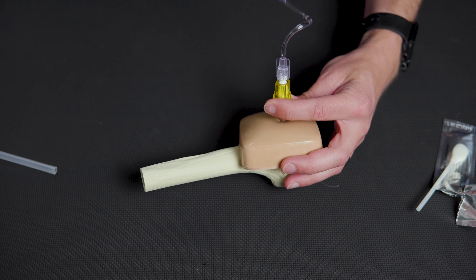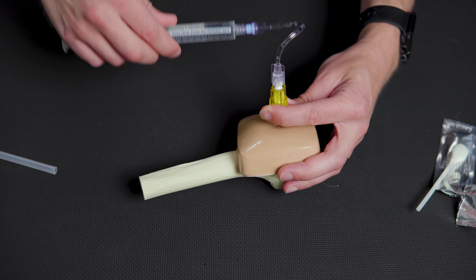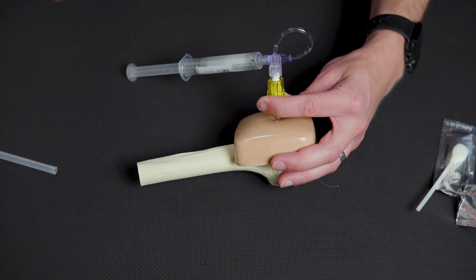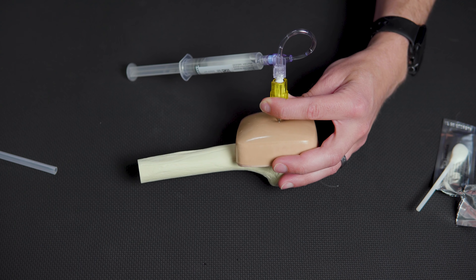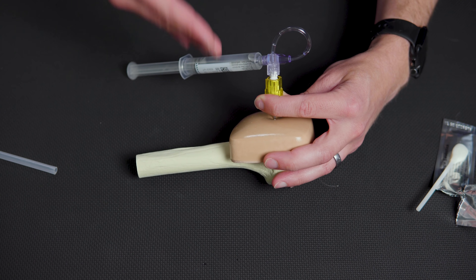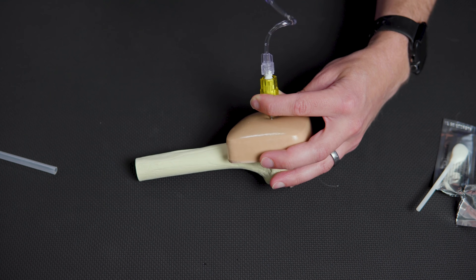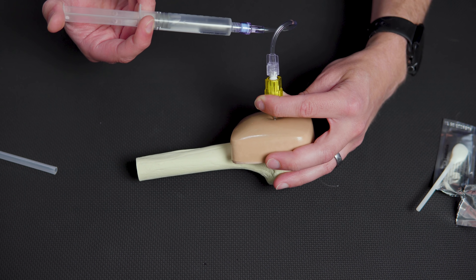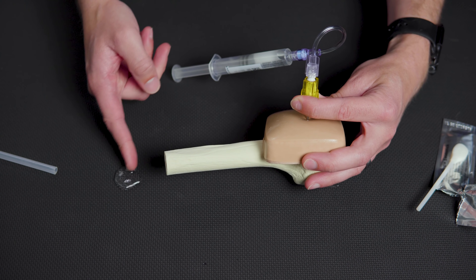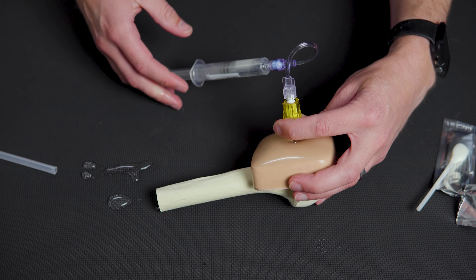Then flush the IO. If the patient is conscious, replace the flush with 2% lidocaine and flush slowly over two minutes. What's actually painful about this procedure — contrary to what you might think — is flushing fluids and increasing pressure in the bone, not the needle insertion itself. If the patient is unresponsive, flush relatively quickly to open up the space. You can see on the model fluid coming out the end because it is literally a hollow bone. You can then attach IV fluids; if running fluids by drip, use a pressure bag to help flow.